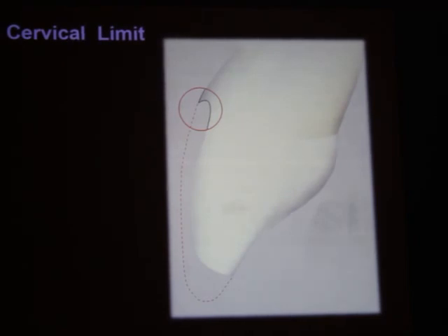If you want a veneer who have say a thickness of 0.6 mm, you need a burr from the tip is at least 1.2 mm, double than the size of the veneer. If your veneer is 0.6, the burr need to be 1.2.